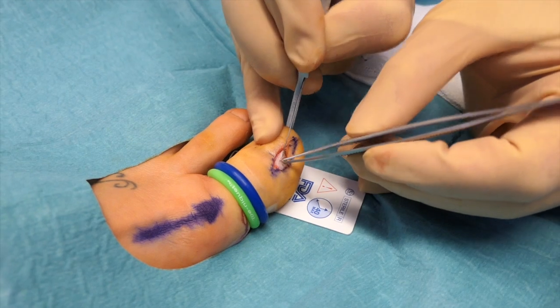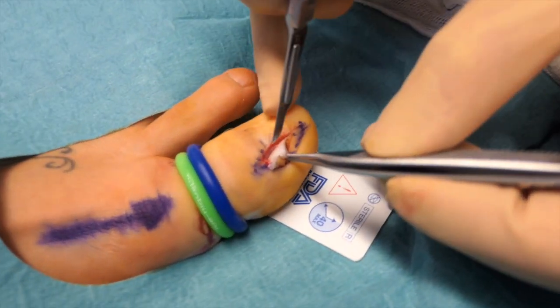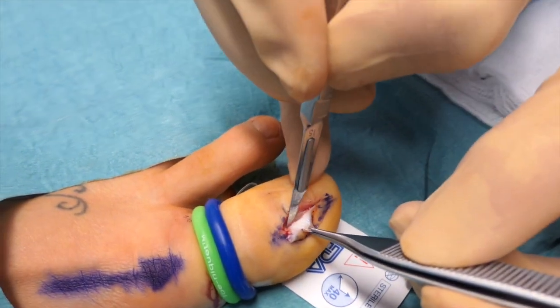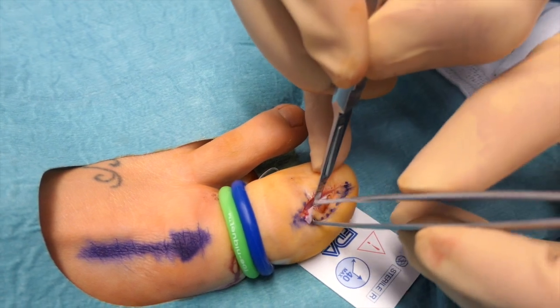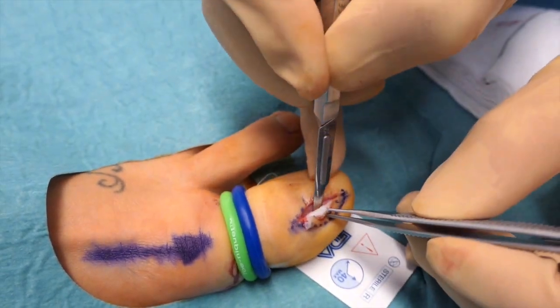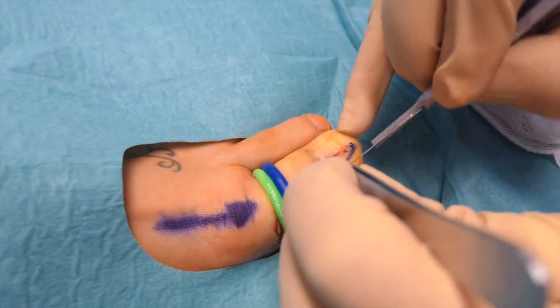And if you can see, Rory, can you see on the underside of that? Can you see all that thickness on the nail where you've got quite a thick nail there? Yeah. Or nail bed, bit of scar tissue. So this is all this tissue. In Latin, it's known as tissue crapola, or crappy tissue, but mostly scar tissue.